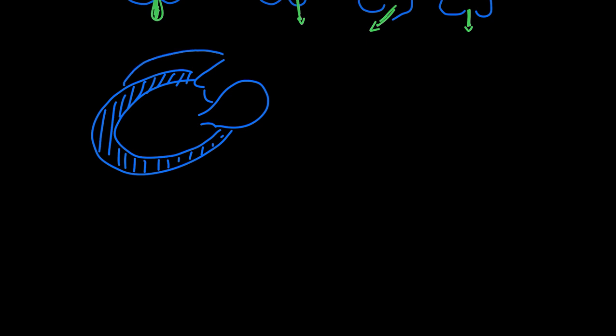And so we've got a jet of blood. You may see a little zone of convergence here. You'll see it come to its narrowest point, maybe just somewhere right down there. And then you'll see a jet of regurgitation. And as we've talked about in other regurgitation videos, it can be tempting to just look at how large the regurgitant jet is in the left ventricle, but we have to be careful since our machine settings can make us over- or underestimate this, and if it's an eccentric jet, then we can be misled. But there is some value in looking at how large the jet is in comparison with the LVOT diameter, certainly.